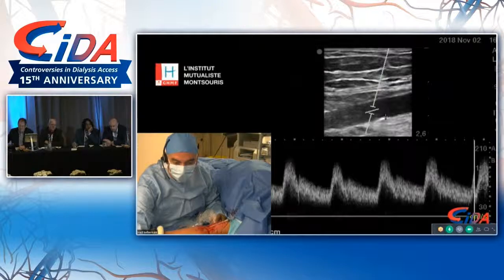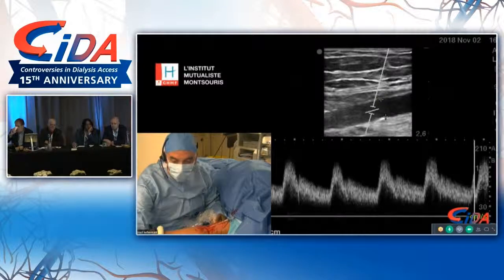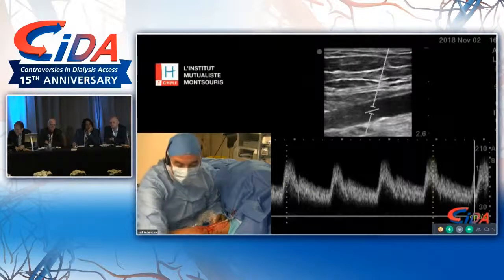And do you need to keep the patient in hospital overnight, or will they go home later this afternoon? No, it's definitely day surgery, and to be honest, I think in a few years we'll be able to do this in clinics. You see all these things here, we do it in surgery, but I think it's overkill for sure. The procedure is so simple.